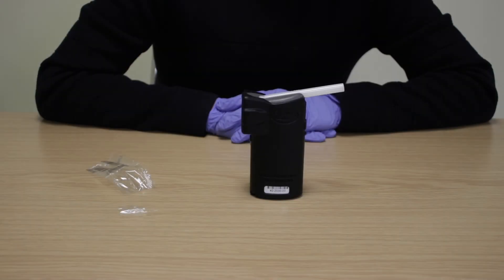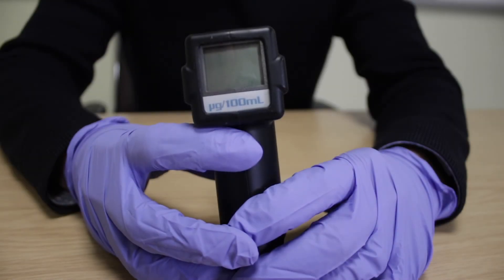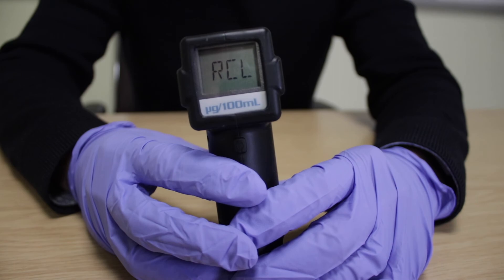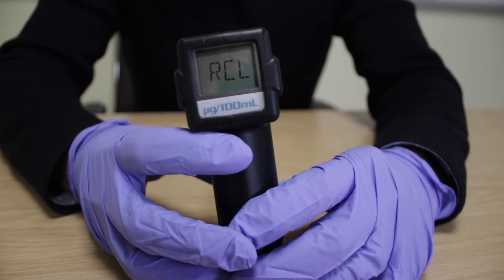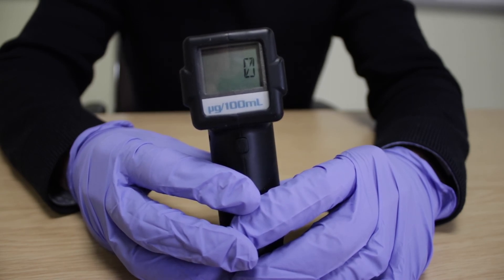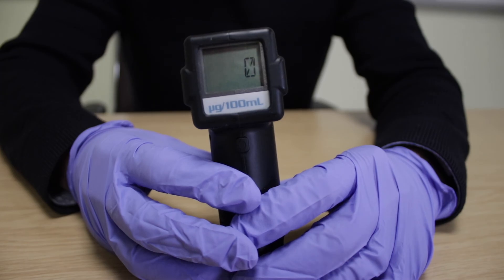To display the last test result after the instrument has powered off, press the off button with your thumb whilst pressing the on button with your index finger. The display will show RCL — recall last test. Press the off button to display the last test result, flashing between RCL and the last result, before turning the device off.